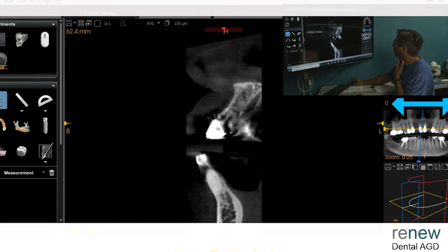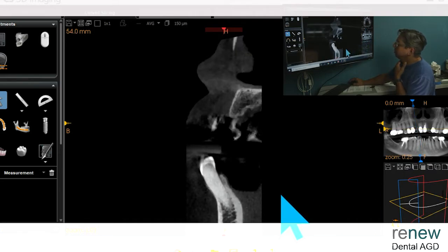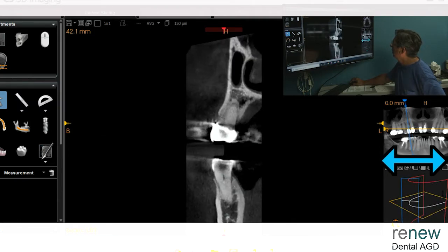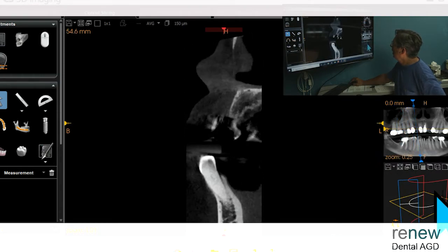The bone density is good. And then when we go over to number 7 here, that's number 10. We have a little more bone, but that doesn't really help us if we've got 9 and 10. But it looks very similar. You got a little more thickness, but we're still stuck with what we're stuck with. So I don't know. We never treated this patient. That is one big canine. Yeah, the rest he could live with. I mean, the rest is okay.